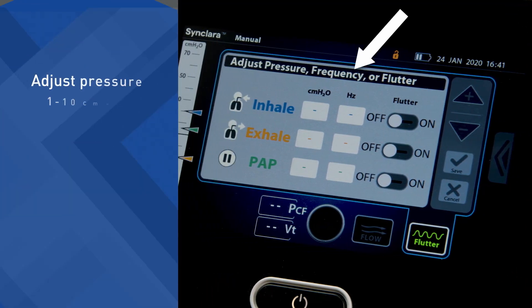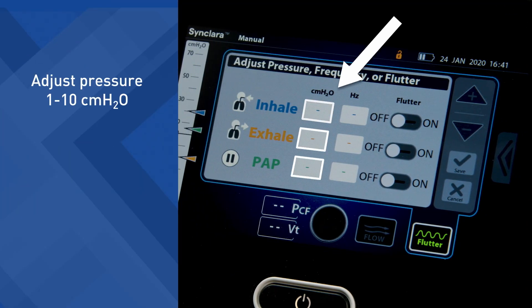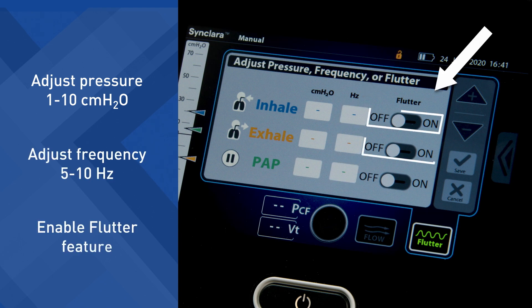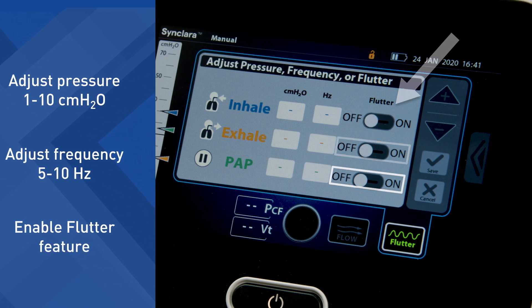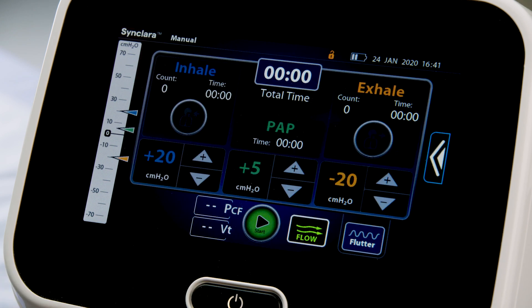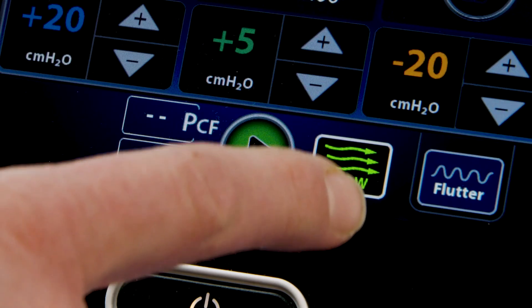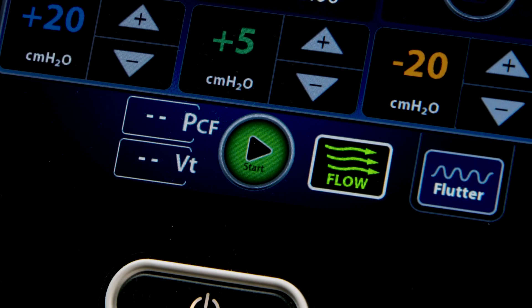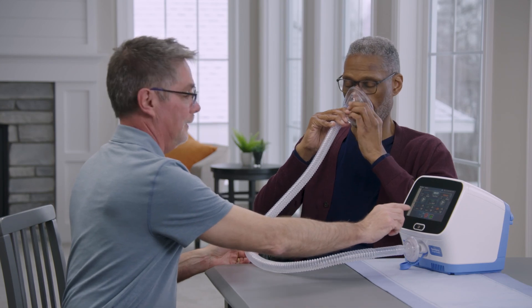In the Flutter settings, you can adjust the pressure between 1 to 10 cm of water, the frequency between 5 to 10 Hz, and enable or disable the flutter feature. To return to the therapy screen, press the flutter control. Once therapy begins, you cannot adjust flutter. If required, press Flow to toggle between different intensities of air movement during the therapy. Now you are ready to begin therapy.